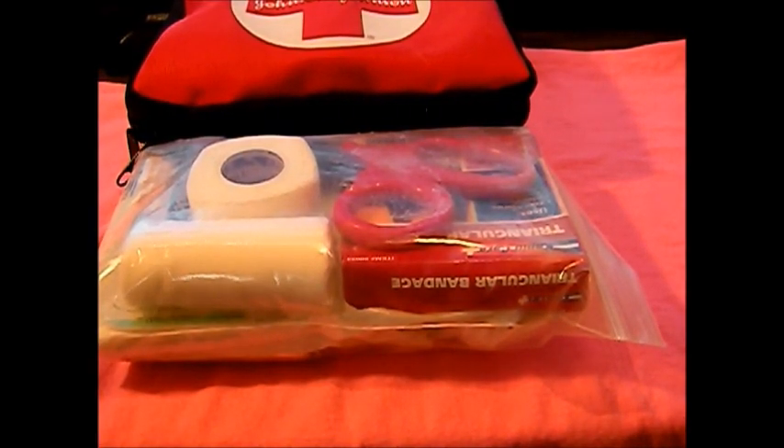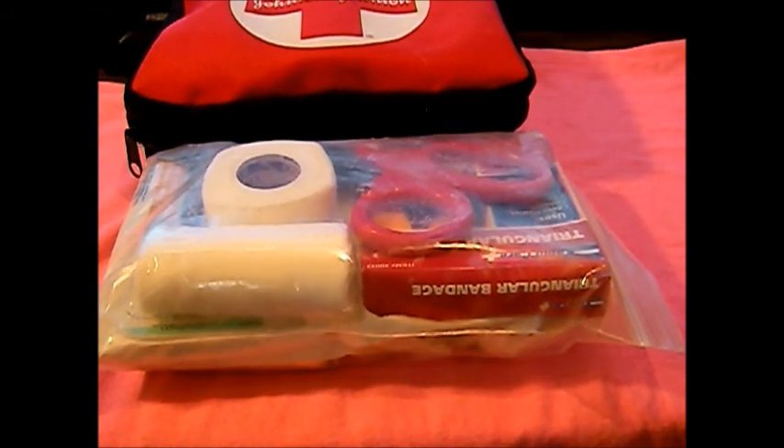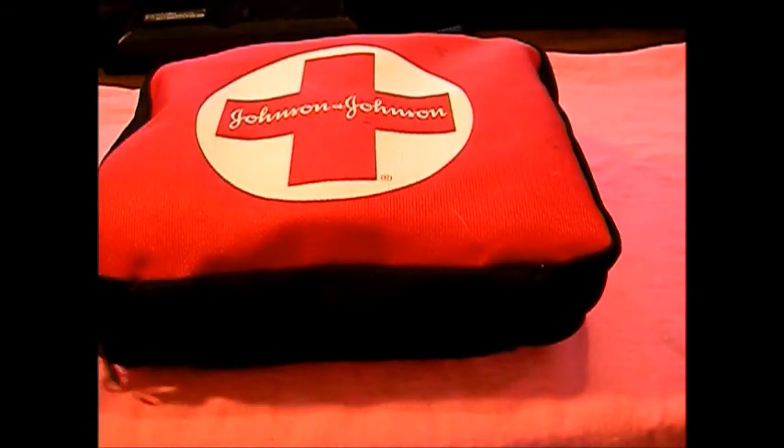Hey YouTube, Rando here. Today's going to be an attempt to upgrade the trauma pack that I keep inside my bug out bag. This isn't going to be complete at the end of this video, so we'll definitely do an update and show you when we complete it. I have the majority of the materials I need to make the pack. This is my current one — what I carry inside my bug out bag.